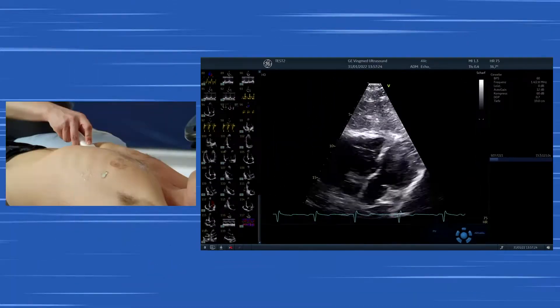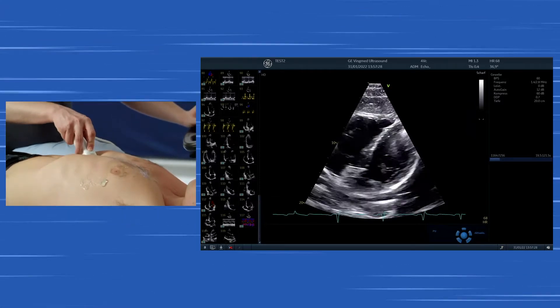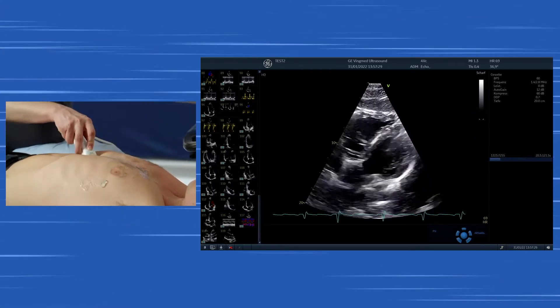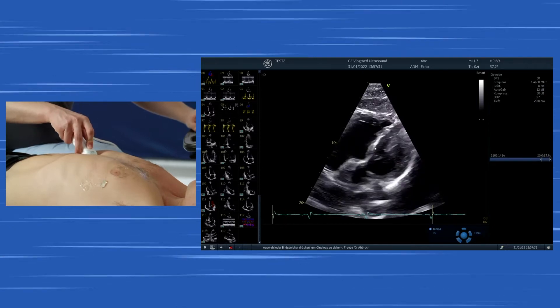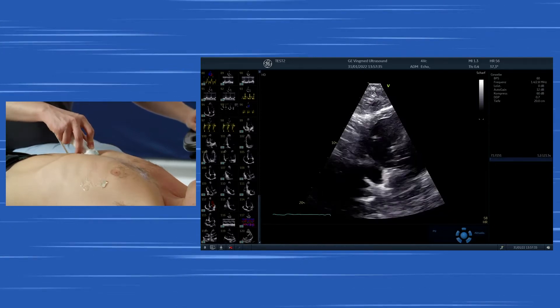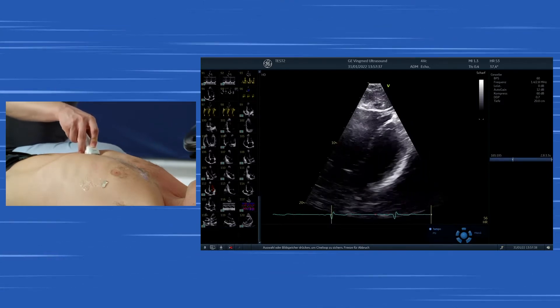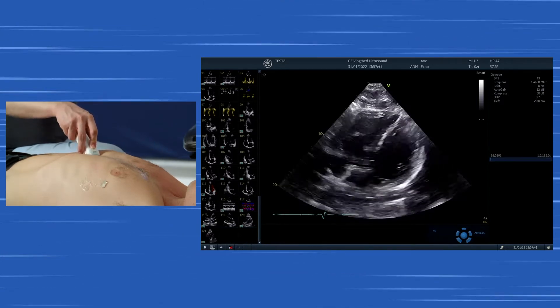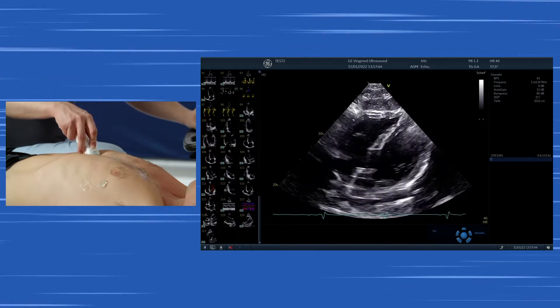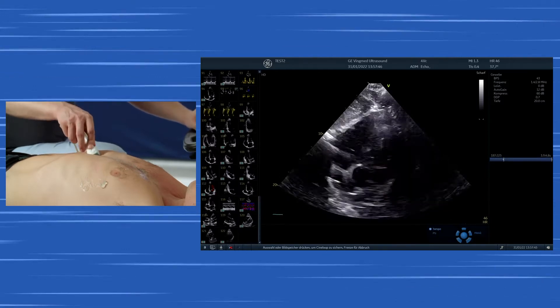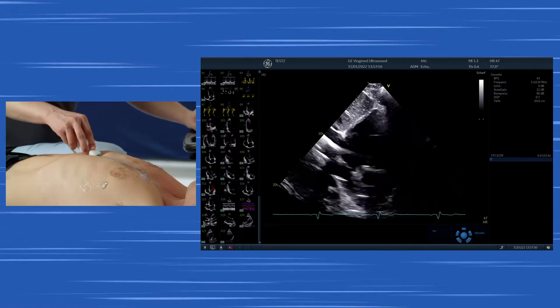First, we have to use more depth — approximately in the range of 20 centimeters. As you can see on the lower left of the screen, we always need enough depth to really visualize the entire heart and the entire pericardium. We grab the transducer from above and try to visualize the heart optimally. We can also broaden the sector a little bit to get additional views.